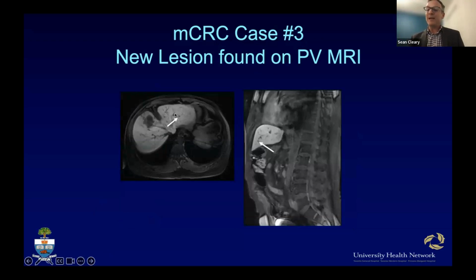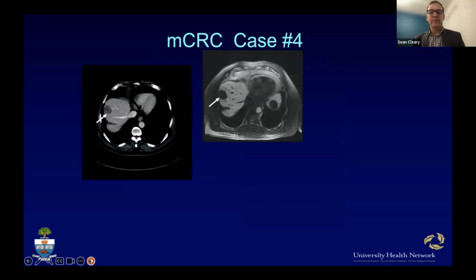This patient still remains resectable, but now we have to remove the whole left-hand side of the liver, plus part of the right, and leave her with the right posterior sector. So you can see that change in operative management with adding Primovist MR to the radiology workup not only shows up in studies, but shows up at an individual patient level. This is the kind of thing that we were experiencing that really convinced us that this was something we had to continue to do.